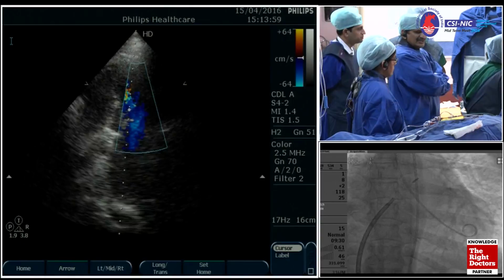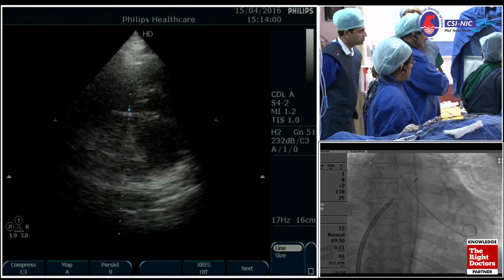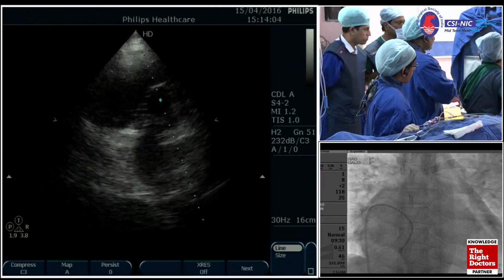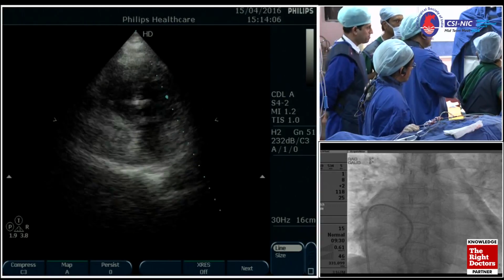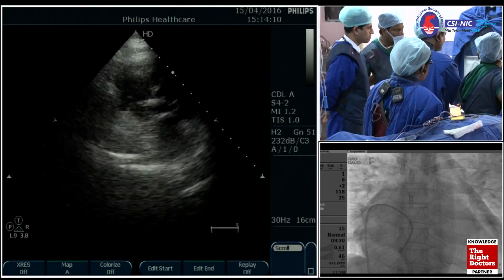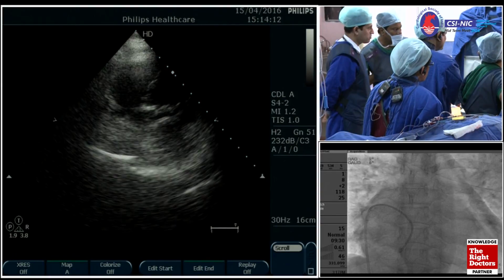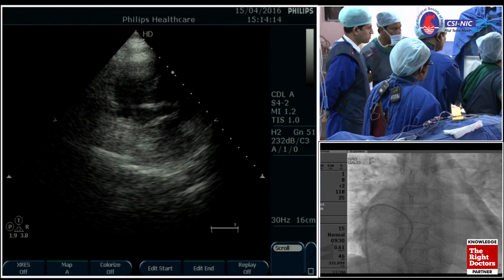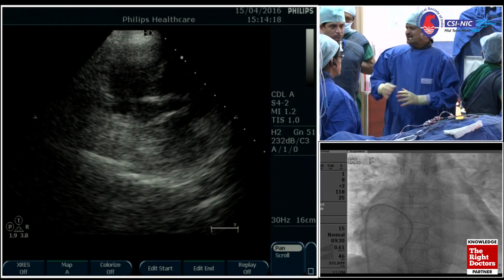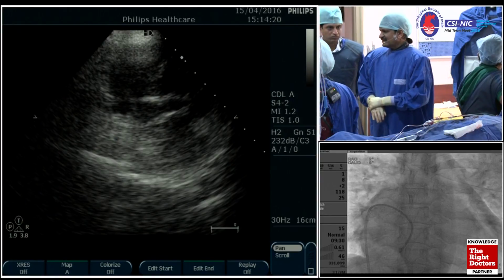Back in the US, you don't get too many of these mitral valves, but every now and then there is prosthetic mitral valve stenosis. So where do you think the septal puncture technique would be useful for you in the US? For these mitral valves, and for atrial appendage occluders, it's very important.